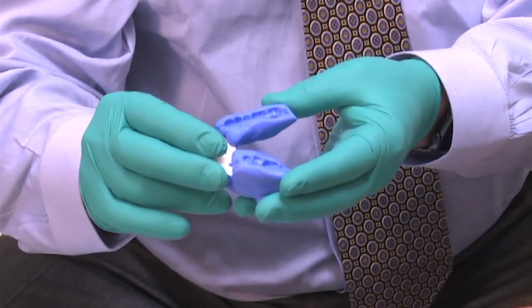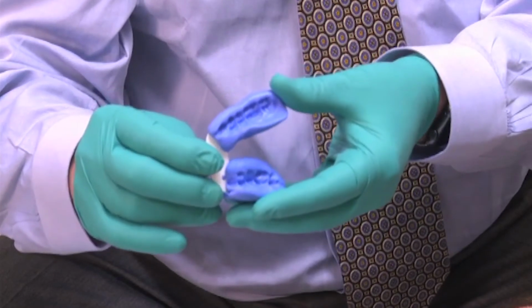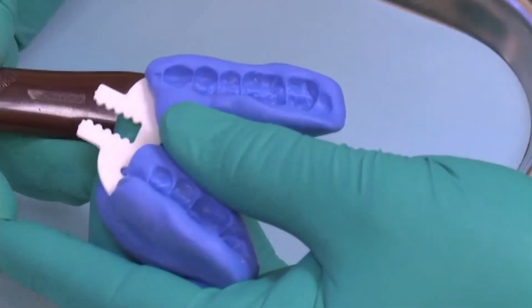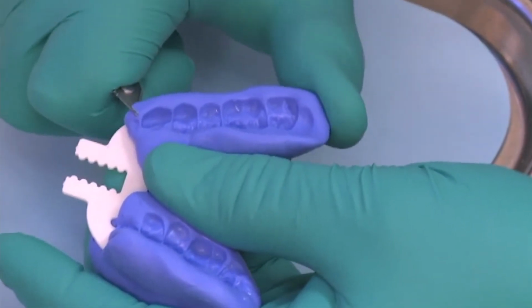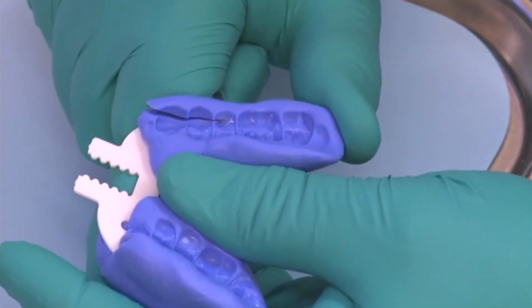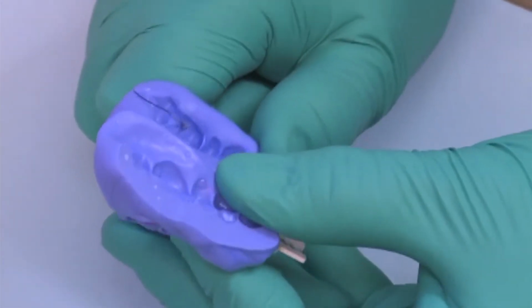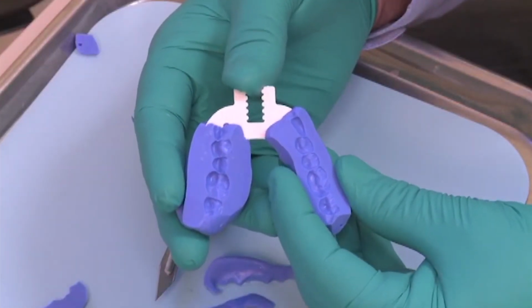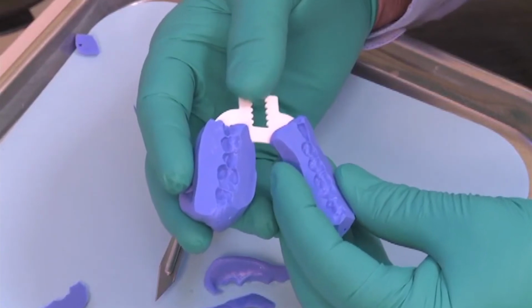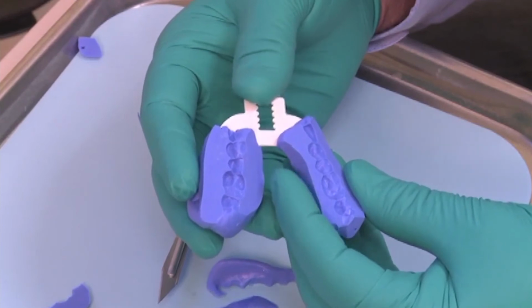And I will trim this now and then reseat it to verify that the bite is comfortable for her and to verify the midlines. I'm going to use a 25 Bard Parker blade. And we're going to trim our bite registration just to have our cusp tips, just like you would trim a crown and bridge bite registration. So we've trimmed our bite registration, and we're going to go back to the mouth, seat it, verify that the midlines line up and that Kim is comfortable with this in place.